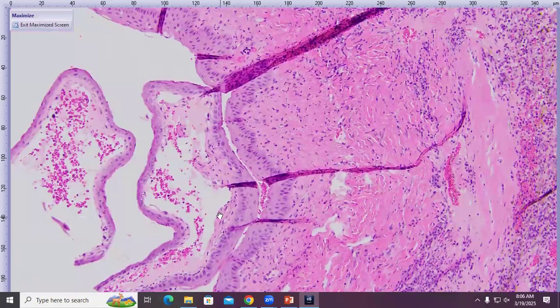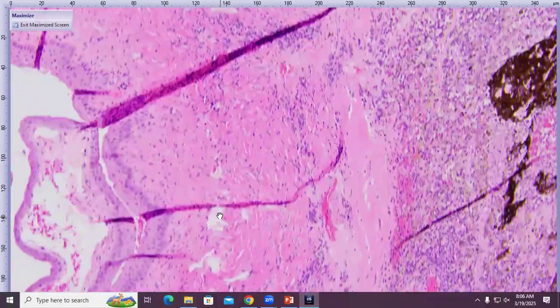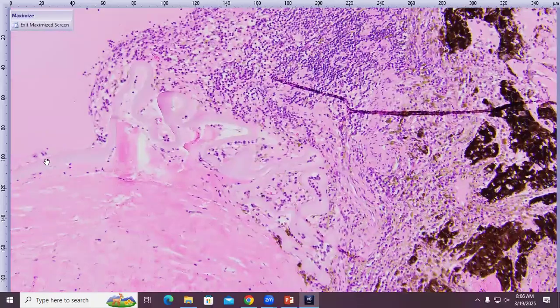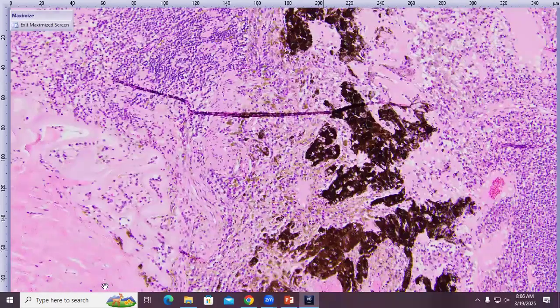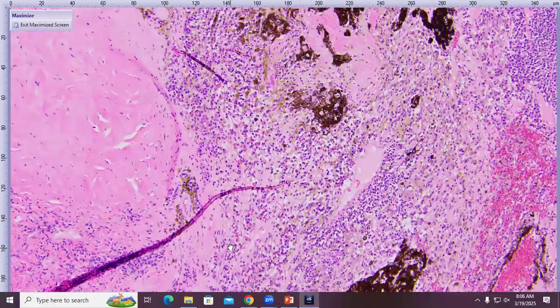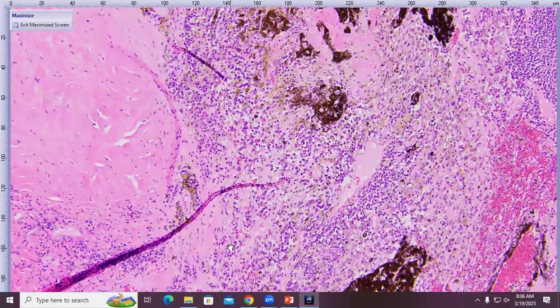And this is what it ended up looking like. Anyway, so as I said, Descemet's is discontinuous. So here is Descemet's membrane. It's all convoluted and it stops somewhere in here. And then what we have is this uveal stroma, which is blending with the deep corneal stroma. So this is at least an area of anterior synechia.